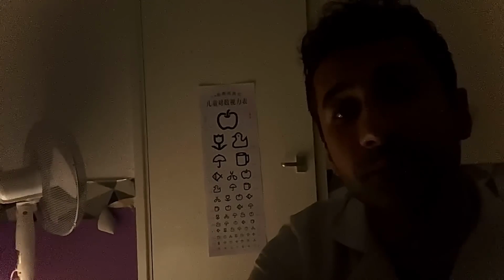Okay. Looking at that lowest row, is it clearer with the lens or without? With or without? And now the next lens, we've gone from plus to minus. Clearer with or without? With, without, or about the same? Fabulous. Okay, we have one more refinement check to do.